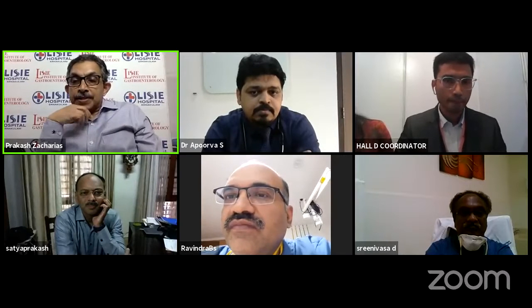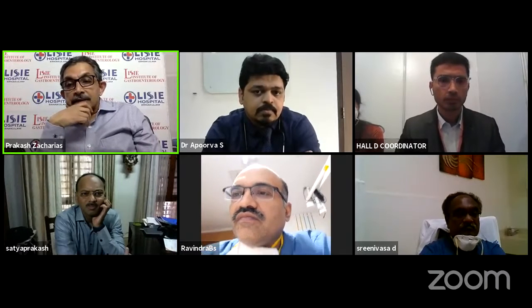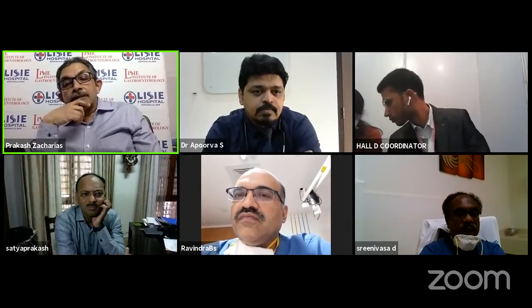Dr. Prakash? Yes. After placing a stent, if there is a large amount of debris, like more than 40%, there is a thought that a direct endoscopic necrosectomy at the index procedure itself may be helpful in some. But at the same time, there is a thought that it might lead to complications.